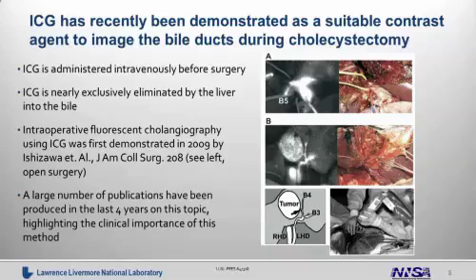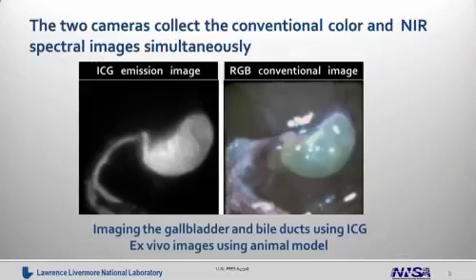In this particular case, the example shown is in open surgery, and the lower right-hand side image shows the operator holding a big camera. We want to do this using a laparoscope. We want to demonstrate this technology that can happen laparoscopically. And that's the goal of the work I'm going to show you next. This is very exciting work, and lots of publications have been produced in the last 4 years along these lines.